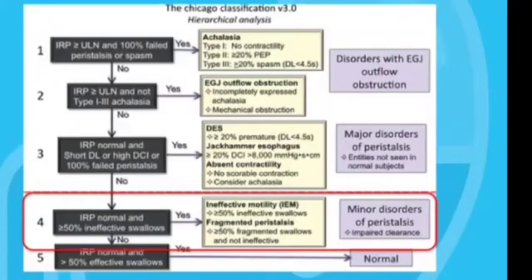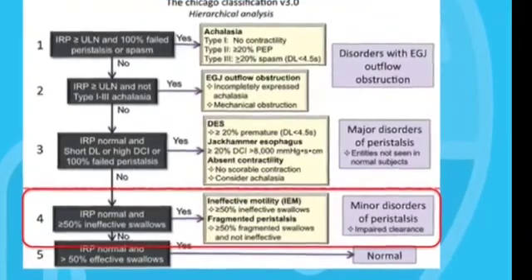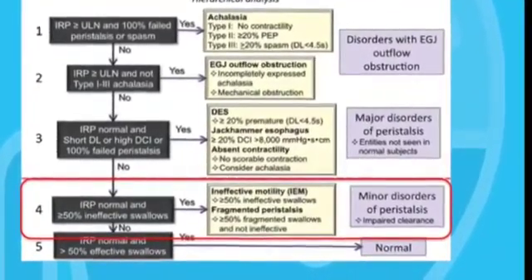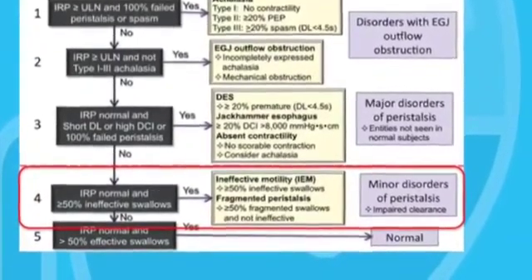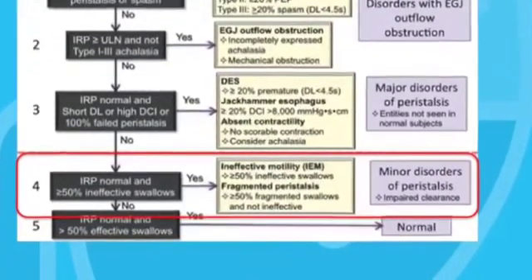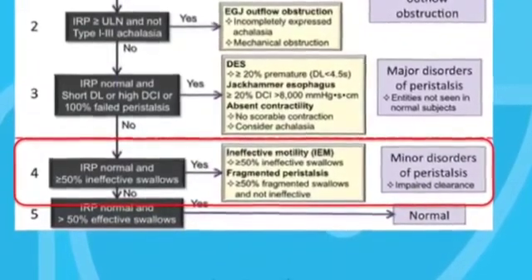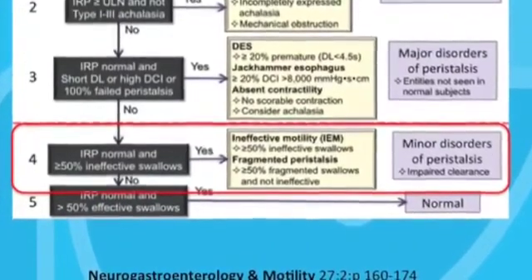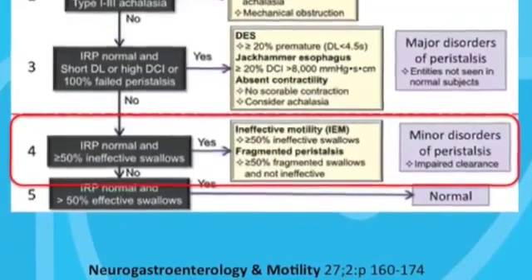Whatever happened to the term scleroderma esophagus? Again, this is a term that dates back to the origins of esophageal manometry. It describes a situation of totally absent esophageal peristaltic activity along with a low or absent EGJ pressure. While this situation can be seen in individuals with systemic scleroderma, it can also be seen in patients without any evidence for this disease. A better term to use would be absent peristalsis with low EGJ pressure.